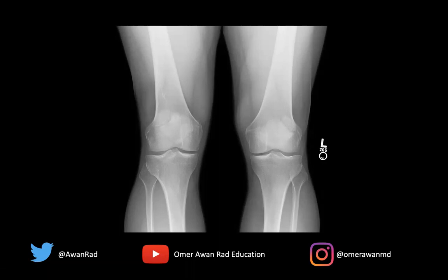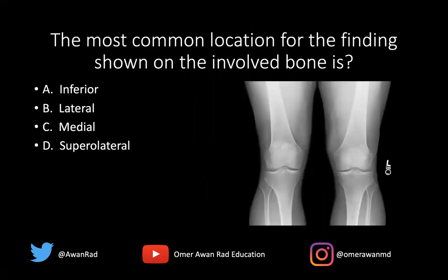Hello everyone, and welcome to MSK Unknown Case Series number 31. We have a frontal radiograph of bilateral knees in a patient presenting with very mild chronic knee pain. The question I have for you is: the most common location for the findings shown on the involved bone is what?